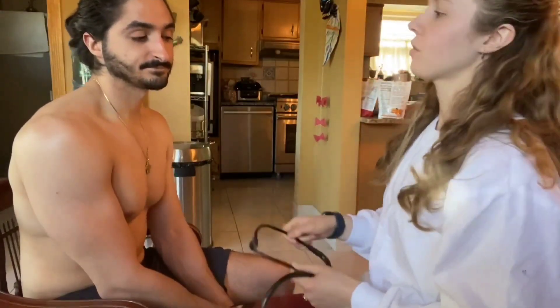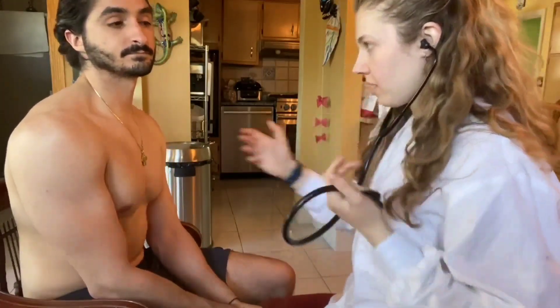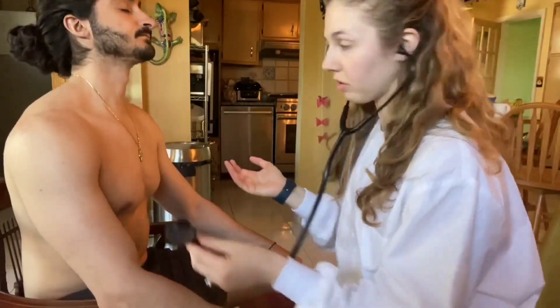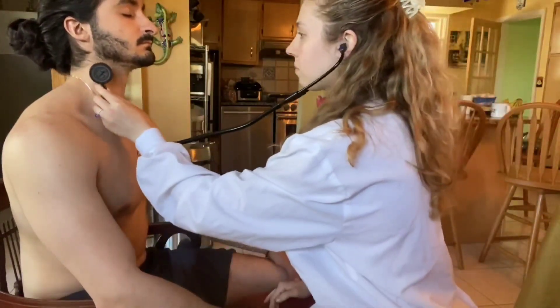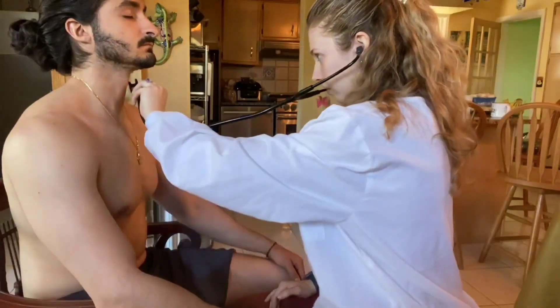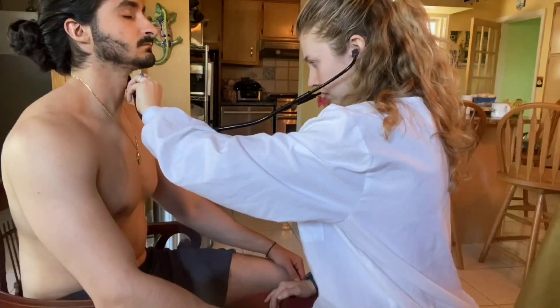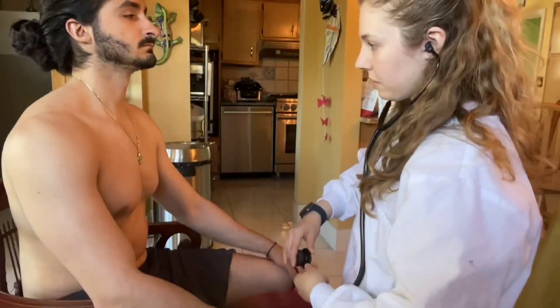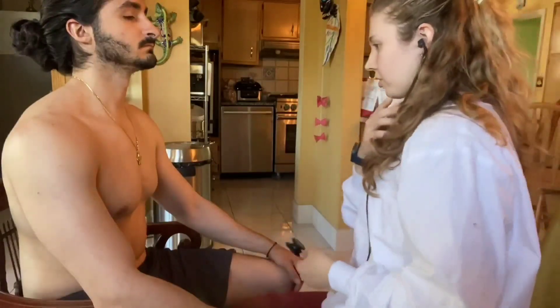We're going to start by listening first, working from head down. We'll take a listen with the bell to listen for any bruits, any thrills, turbulent blood flow. Nothing abnormal, which is great.